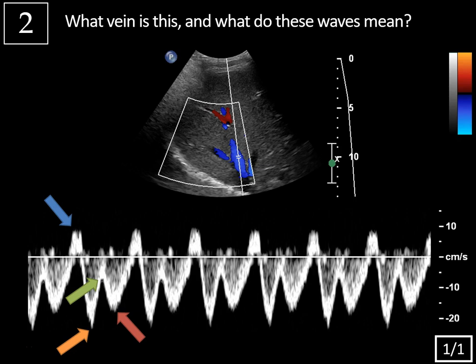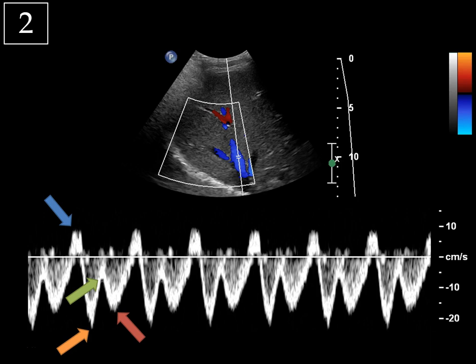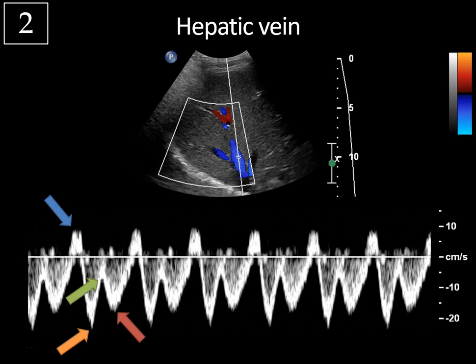What vein is this and what do these waves mean? We're looking at the typical waveform for a hepatic vein — more specifically, the right hepatic vein. On the color Doppler image, the blue area represents blood flow away from the transducer, away from the liver towards the heart, and the red flow represents blood flow towards the transducer, which you typically see in the portal vein. Below we have the spectral Doppler waveform, and for the hepatic vein this is described as triphasic — or more specifically tetrainflexional because it has four peaks. Everything above the baseline is blood flow towards the liver, and everything below the baseline is blood flow away from the liver towards the heart.